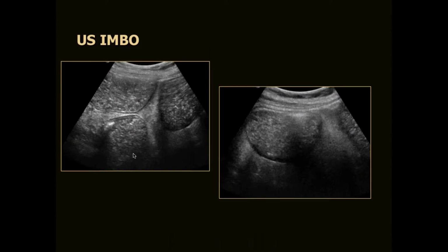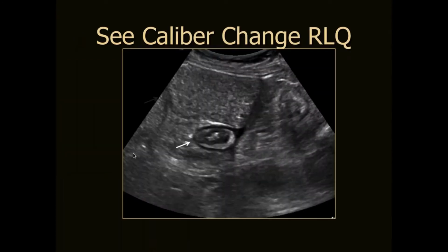So let's look at this same patient who was scanned within hours on both ultrasound and CT scan. So again, as soon as we place our probe on this patient's abdomen, we can see these dilated, fluid distended loops of bowel. So this would never be a normal appearance on anybody, regardless of whether they're fasting or not. And so, of course, we're suspicious immediately that there's potentially a distal obstructing lesion as the most likely explanation.